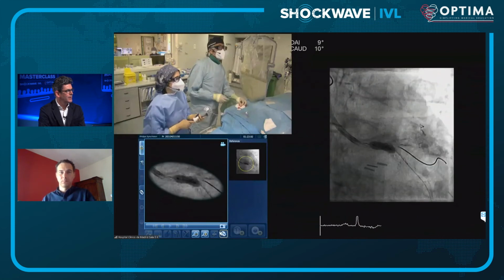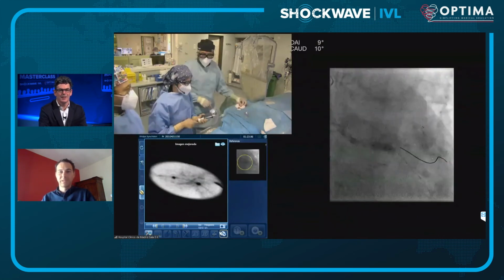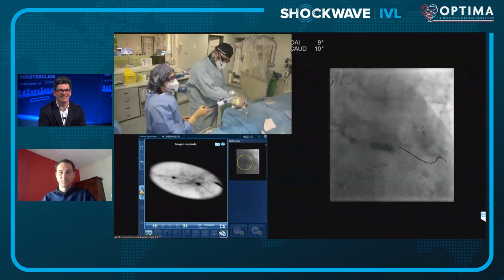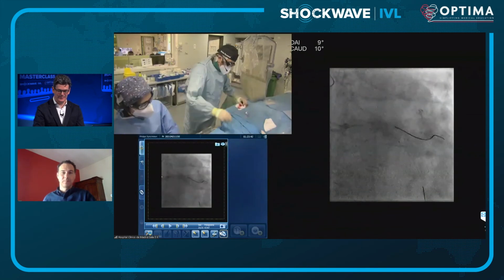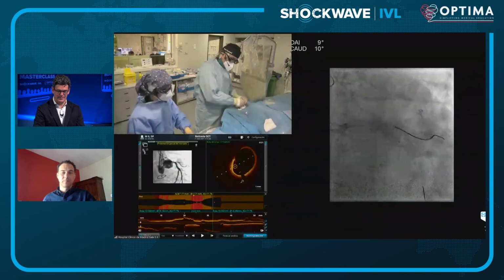Okay. Yeah. Good. Looks good. Looks really good. Yeah, congratulations. So now an OCT to finish. OCT. Yeah, yes. That's correct. And many colleagues will probably, and we discussed that before, think, it's a left main, don't use OCT.